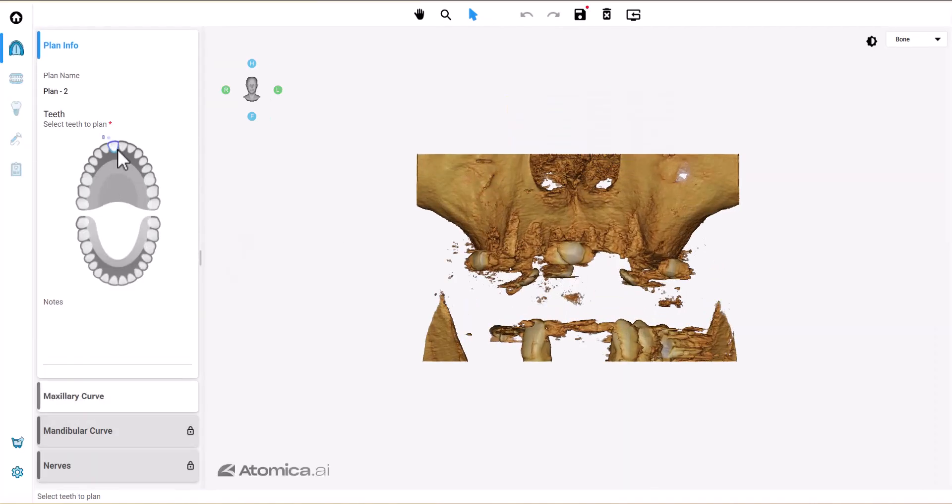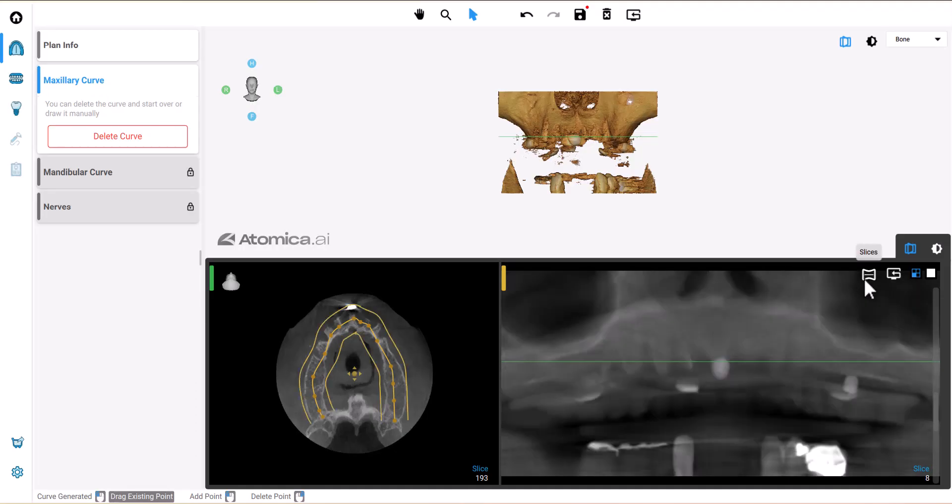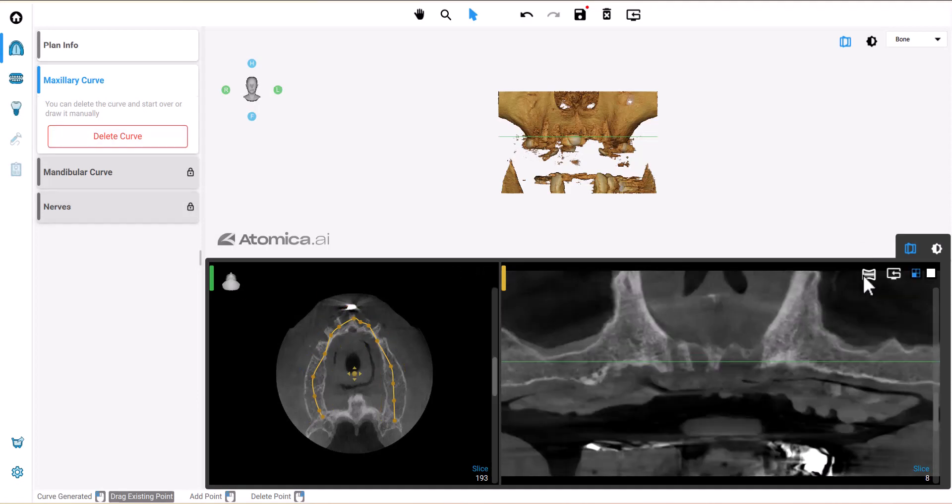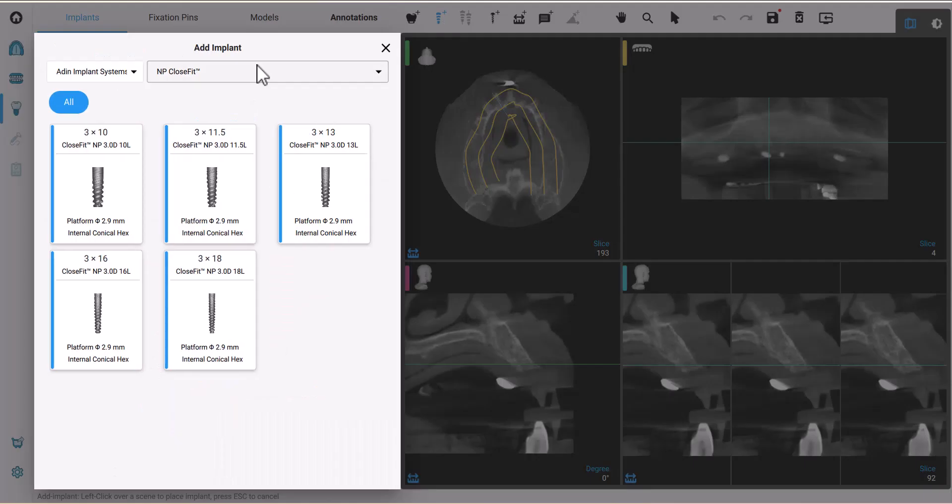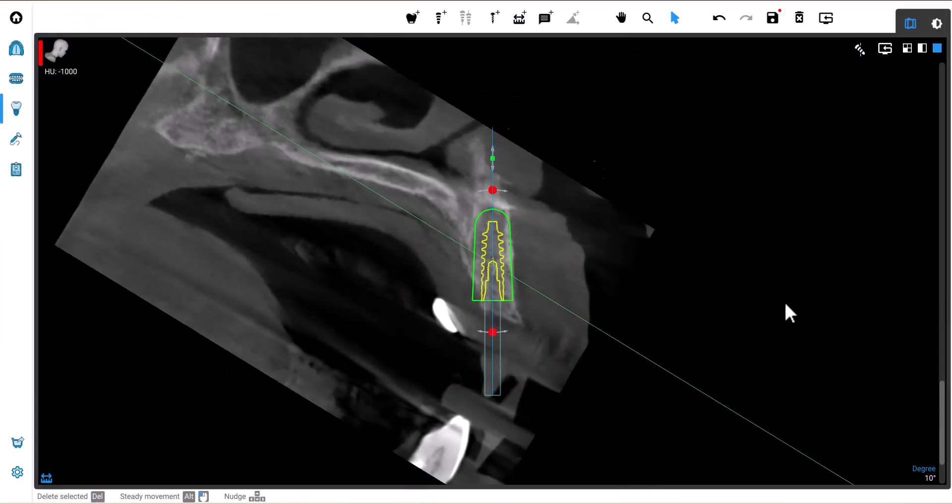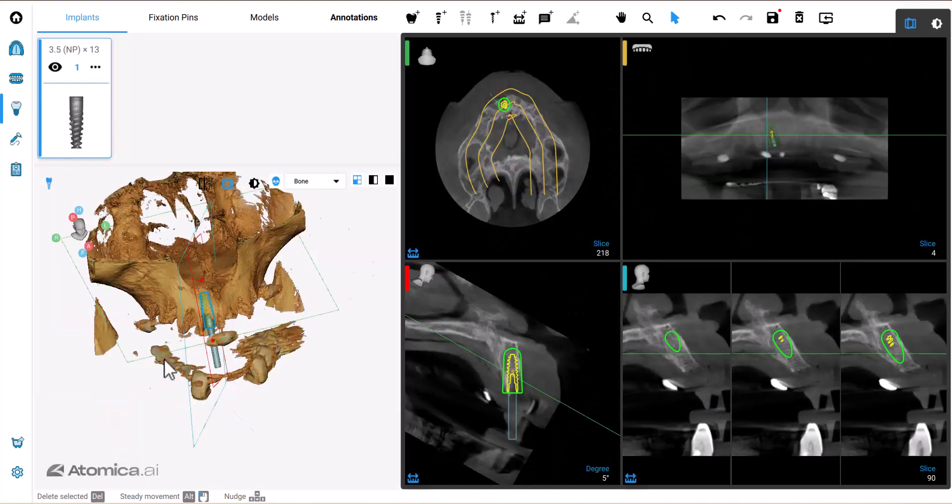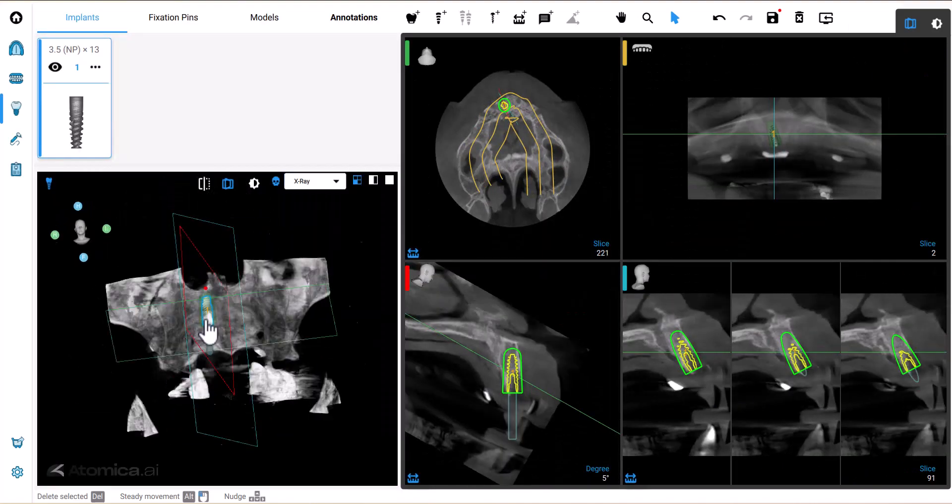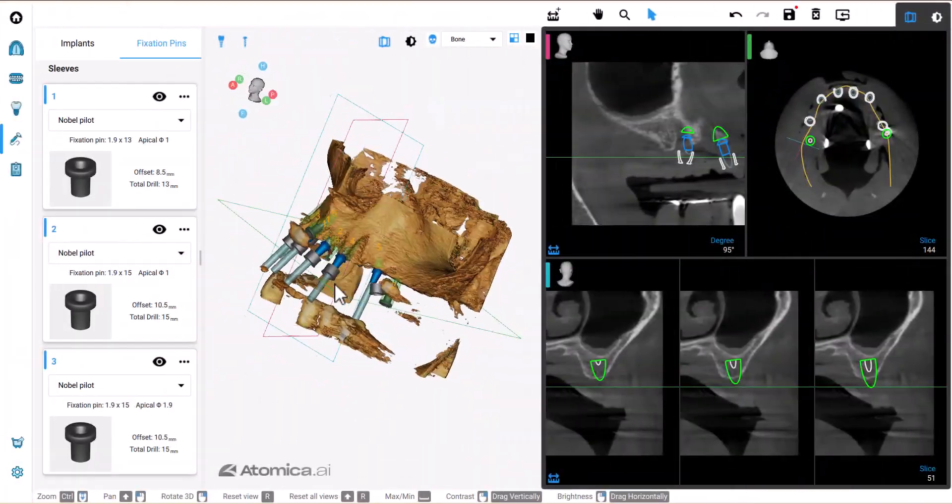I'll select one of the maxillary teeth to activate the panoramic curve and head to the planning tab where I'll select the implants. You can watch more details about implants and fixation pins positioning in the previous demonstrations. Let's also place the sleeves.